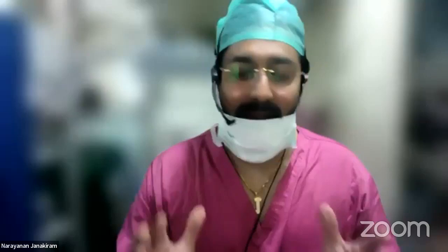Thank you, madam. So you saw extensive cholesteatoma. And then some basic principles. Don't remove it from the lateral canal. Last, you remove it. And then these are all some basic principles which we follow. And I think it'll be useful for the juniors, not people like you, but juniors. But we enjoy watching you, no? Your technique is as good as or even better than what it was before.